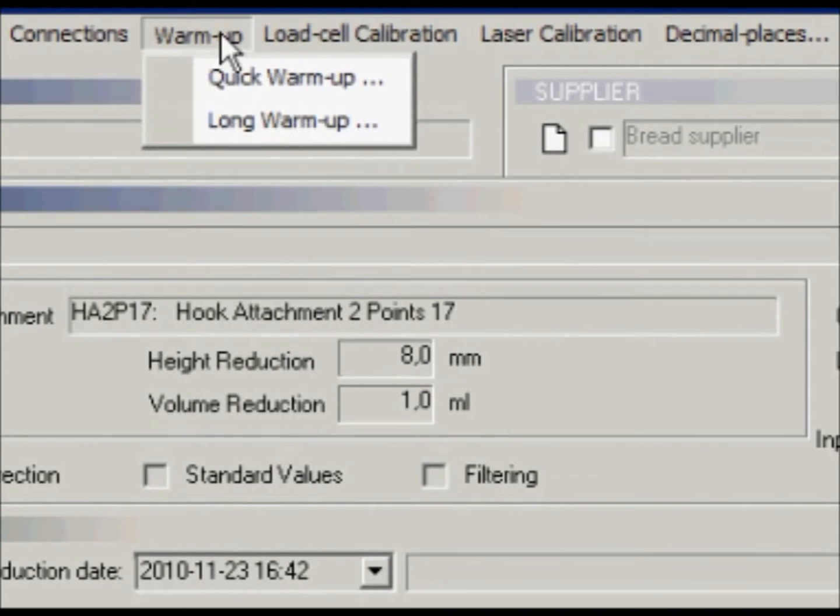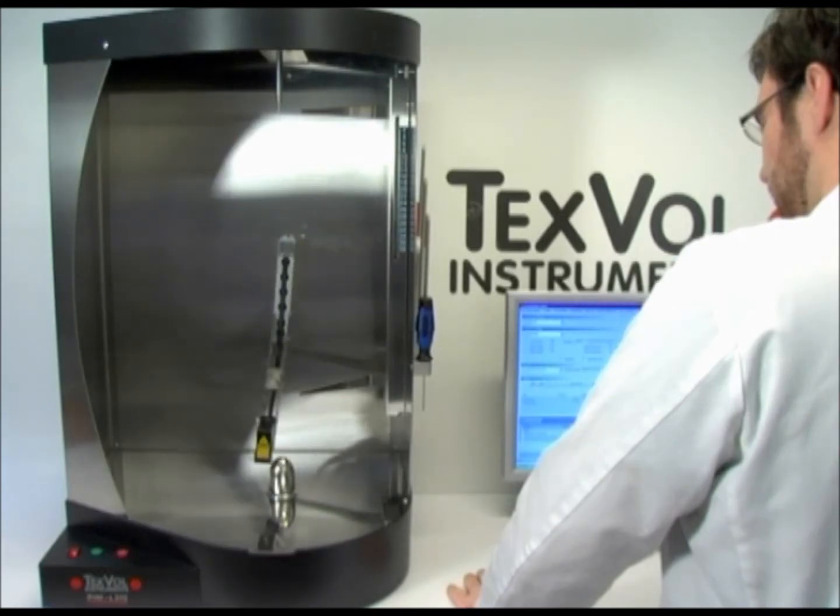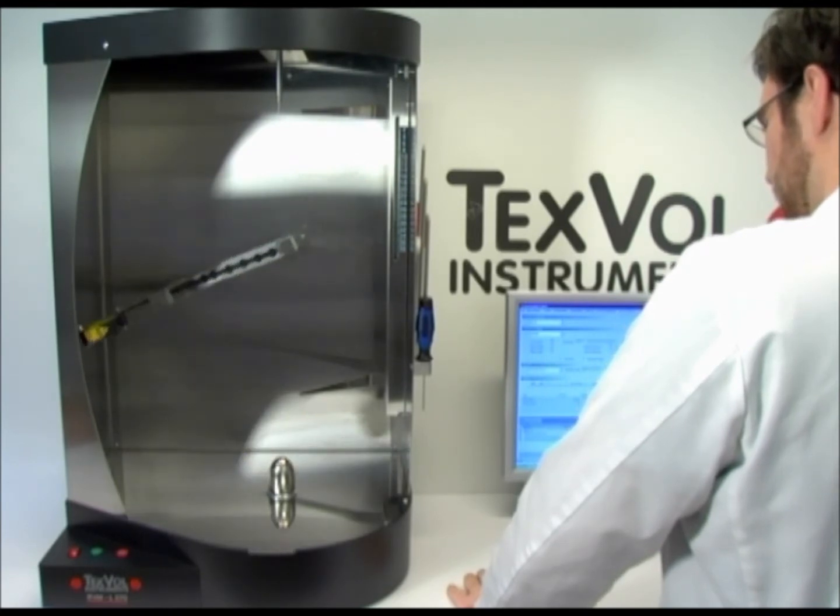Warm up the instrument using the quick warm-up option. The laser arm will move to its horizontal position and the chuck will start to rotate.